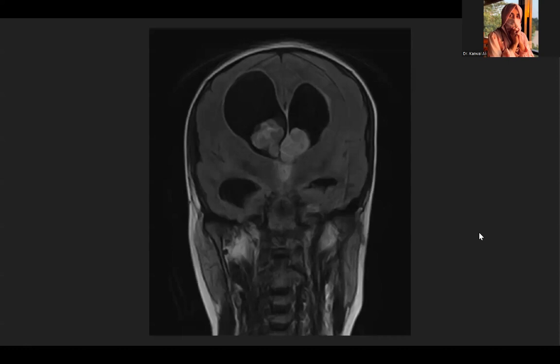What do you think about this one? Can someone else volunteer, please? I am sorry for the bad connection. I've been disconnected. That's completely okay, Dr. Hussain. Do you want to continue with this image?